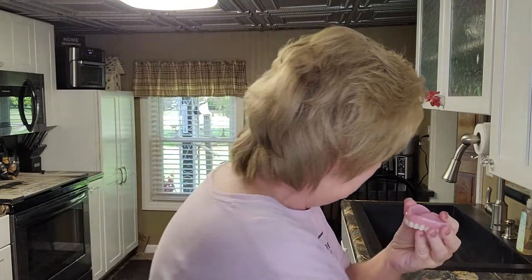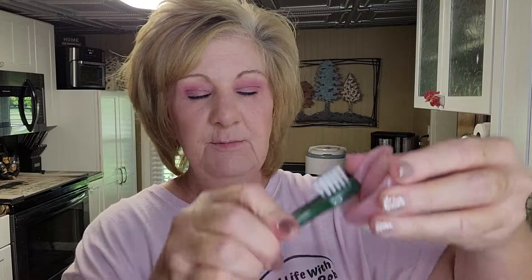Then we have the Fresh and Bright that came in the package. It's straight and unusual-looking — it's very hard, very hard. But it does get in the trough. I've been having trouble with Dr. B's getting into that front trough, so let me show you inside the denture.